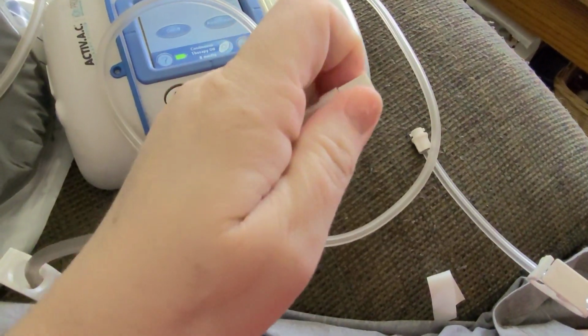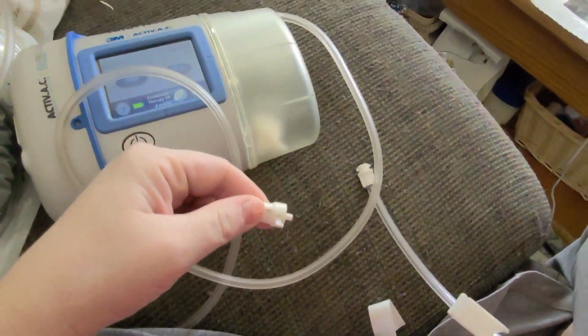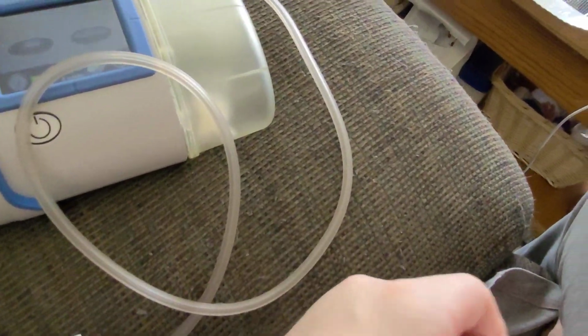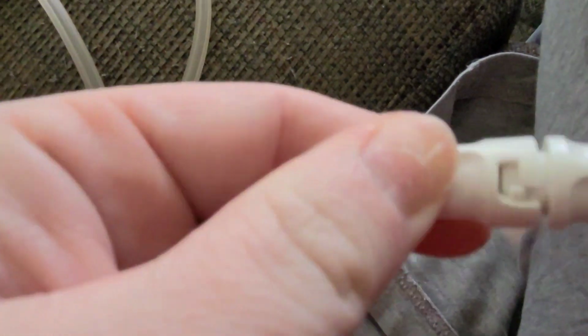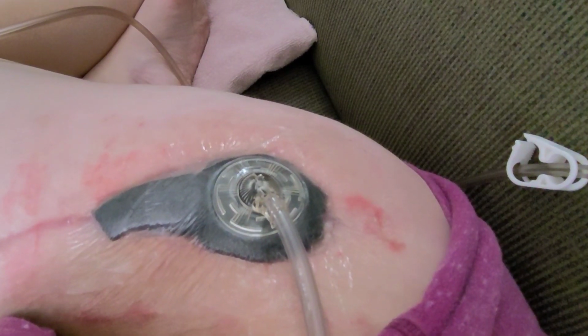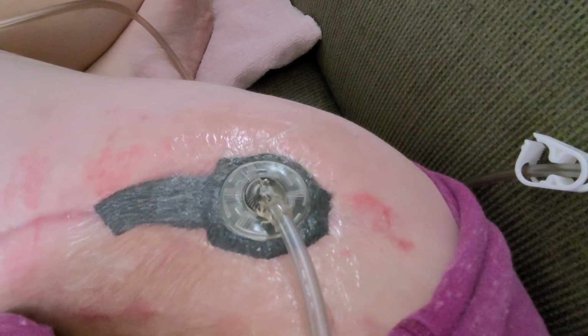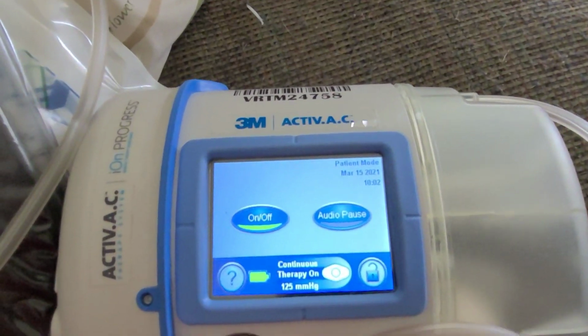Okay, so we are all done. Everything is put on. We just need to hook up this to the other machine, and then this is very difficult to do with one hand. I don't know why I didn't get my tripod out, but I didn't. So yeah, so you just connect these together like that. Okay, then we come back to the machine and hit on. So there it is. There she goes. That's it. And now it's done.